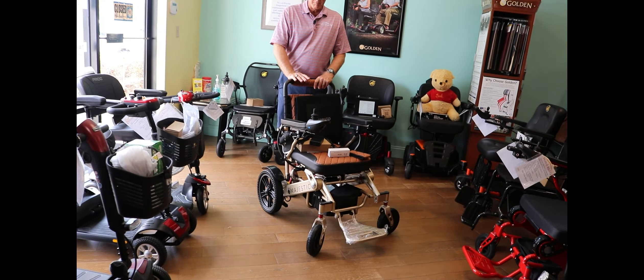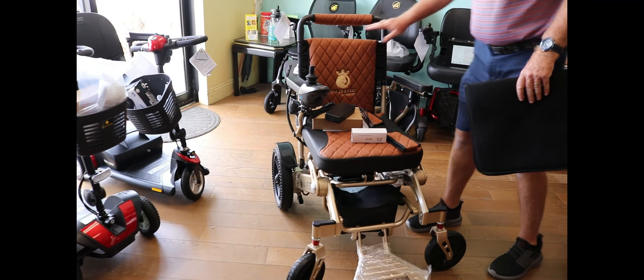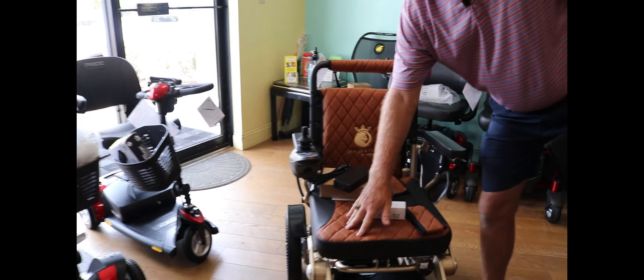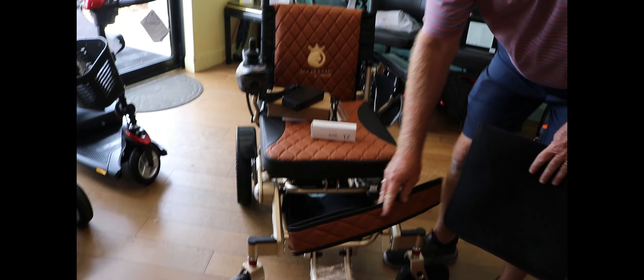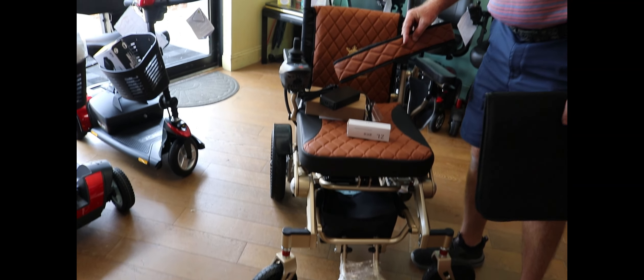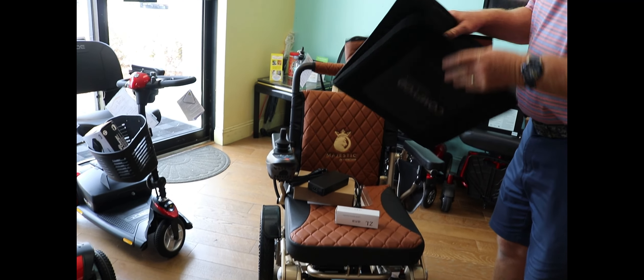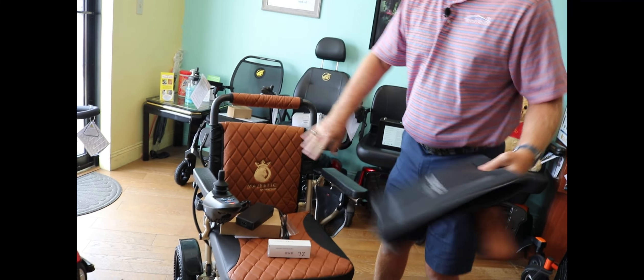It's absolutely gorgeous — you won't see anything like it in the market. You've got this custom upholstery; it comes in various colors. This is the ankle foot strap that goes on the bottom, and there's an extra cover for the backrest if you want something different than what's provided.